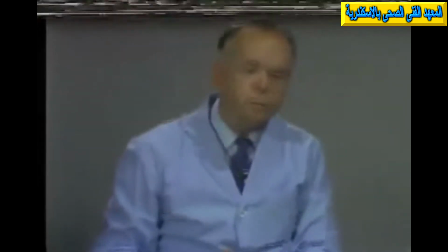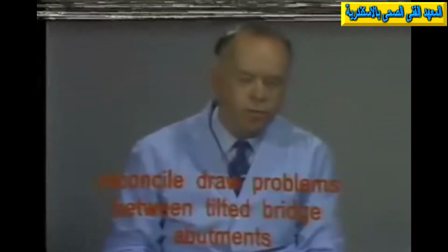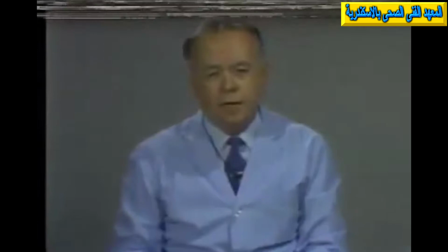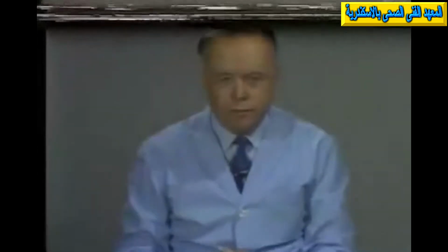Now, the 4 uses of the semi-rigid connector which we want to discuss. First of all, it's used in reconciling draw problems between tilted bridge abutments. You're quite familiar with the mandibular molar situation where this is tilted, and it may sometimes be difficult to cut preparations on the molar and on the other, say, bicuspid abutment, and to get these lined up so that you have a common line of draw.